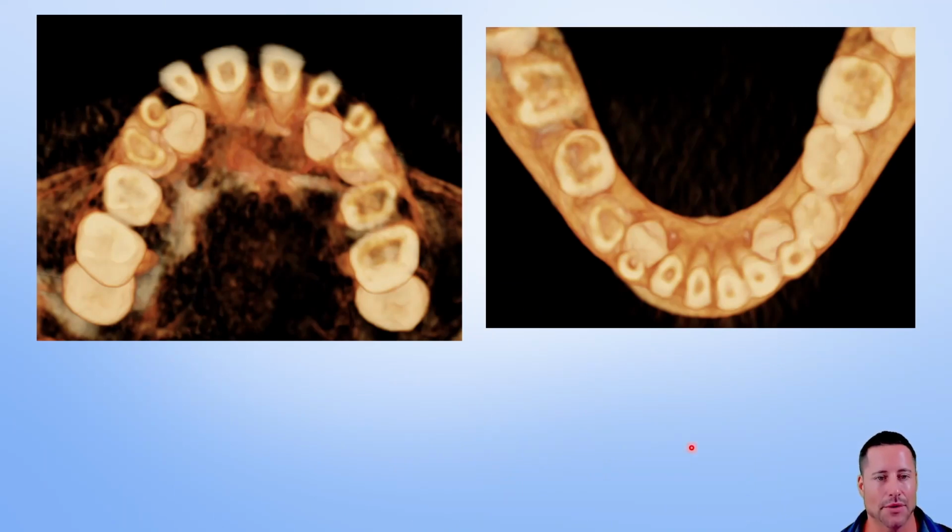Probably not. So now when you send this patient, if you're going to send for extraction of the upper C's, you get the lower C's out as well and avoid her another surgery.